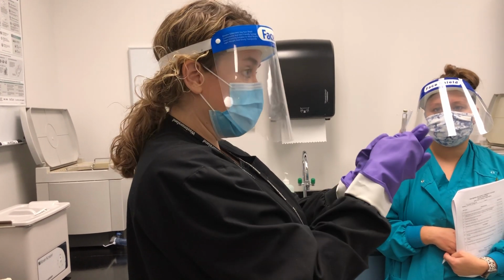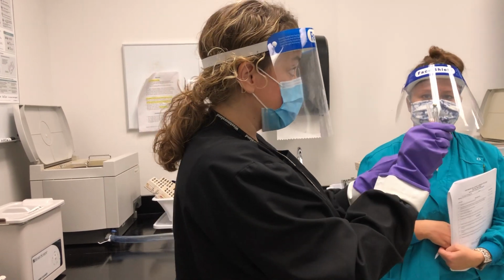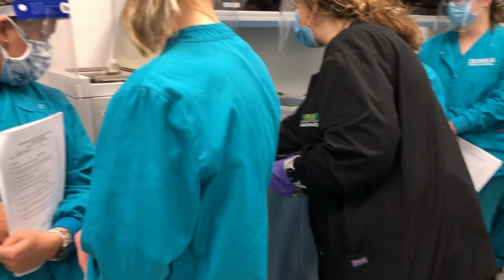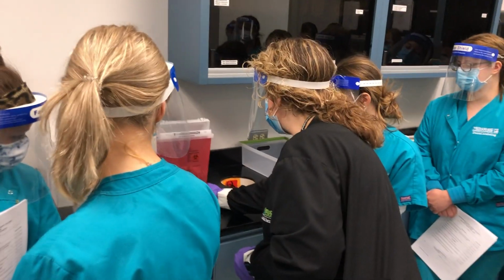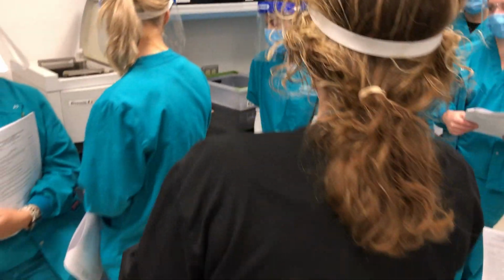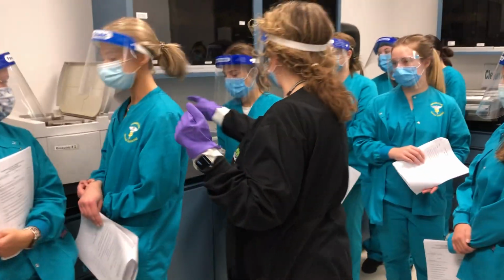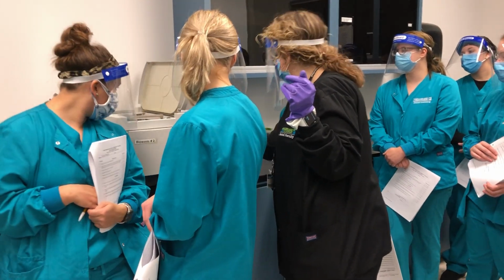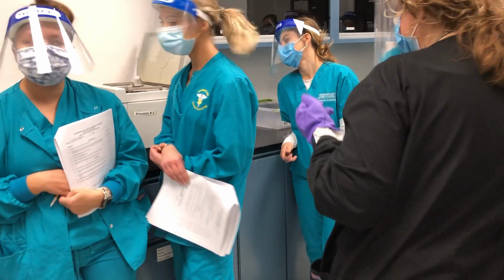And then this is my little needle. So what we're going to do for the point of this process is we're going to bring it over and set it right in front of the biohazard, okay? I'm sorry, right in front of the sharps container. This is the sharps container. It's the red square plastic. We would normally drop it in this little flap right here, and then it drops down into the sharps container, okay?